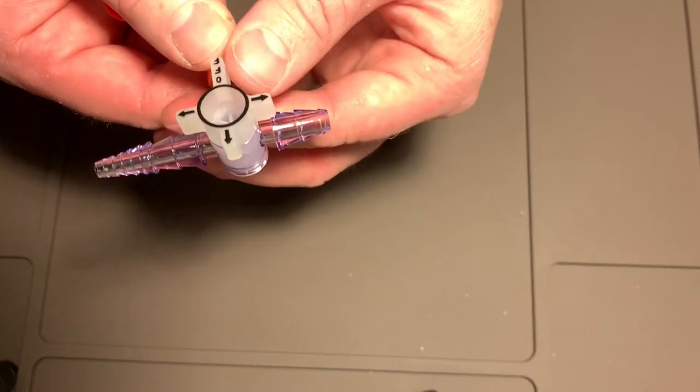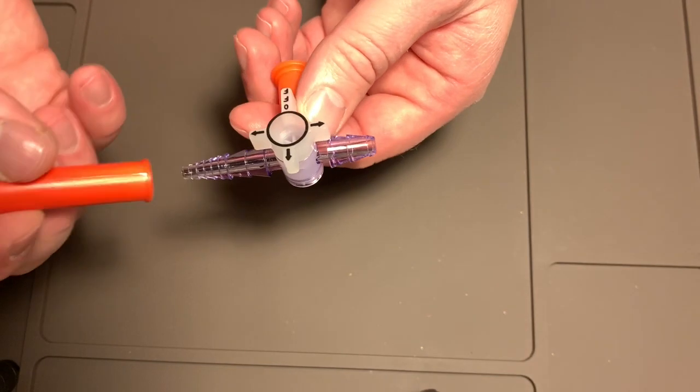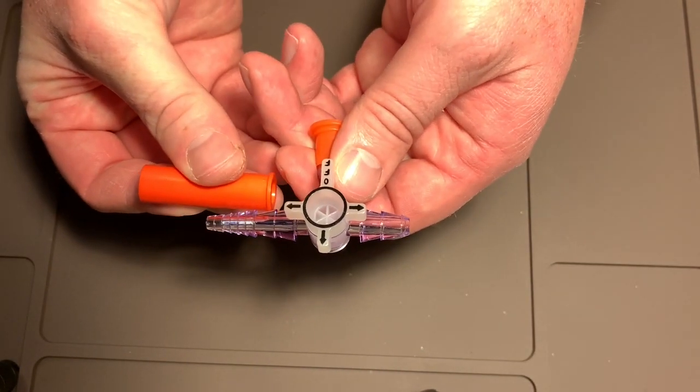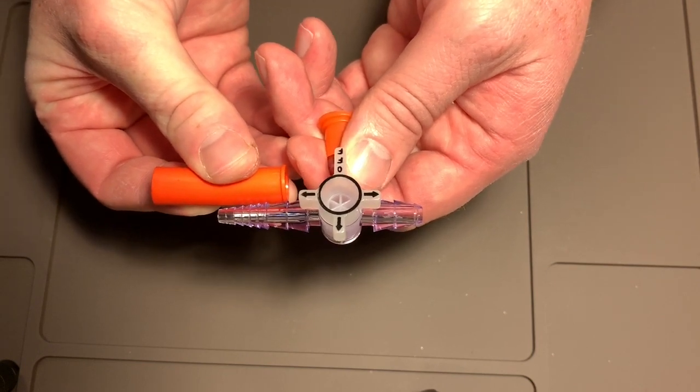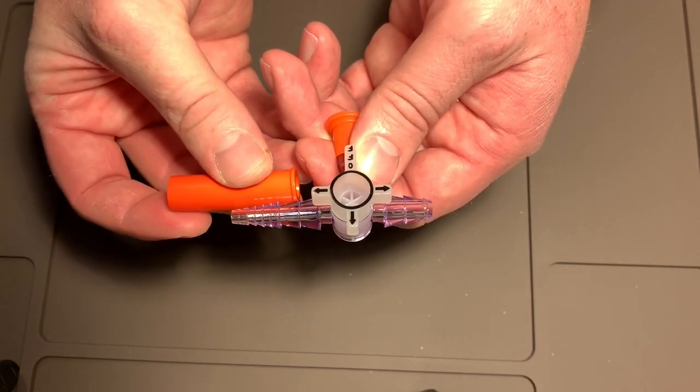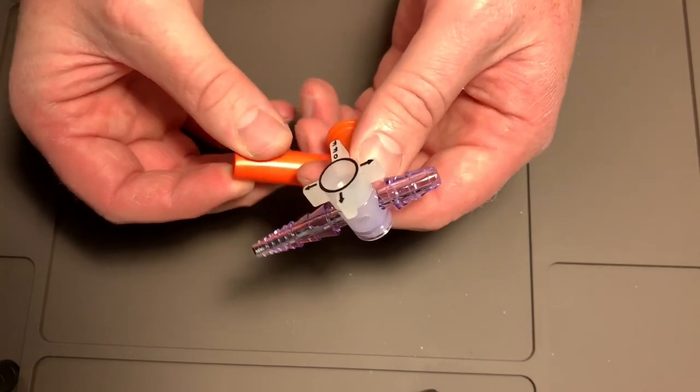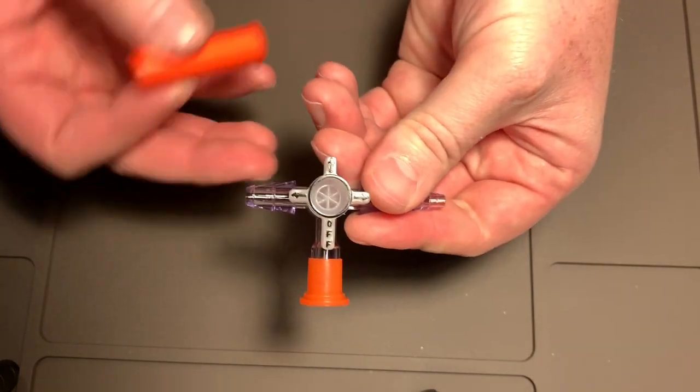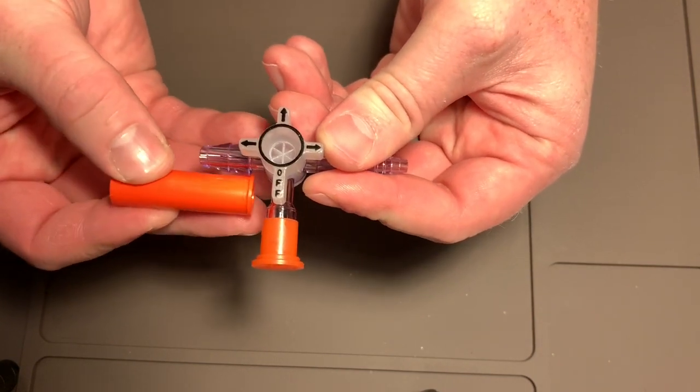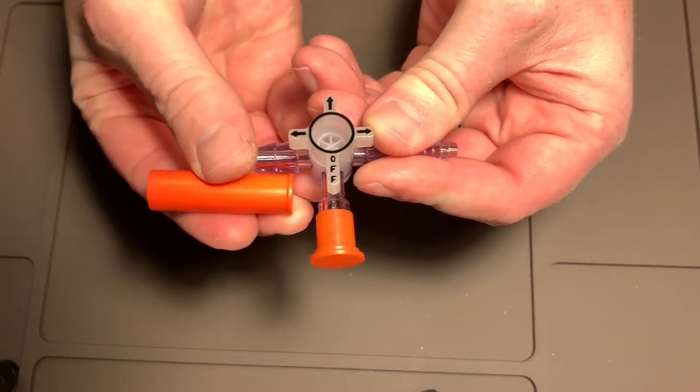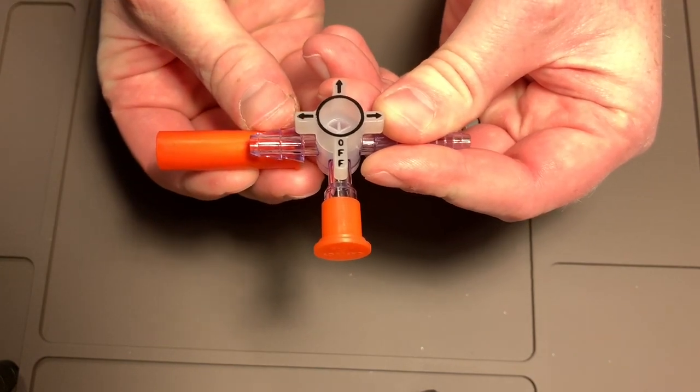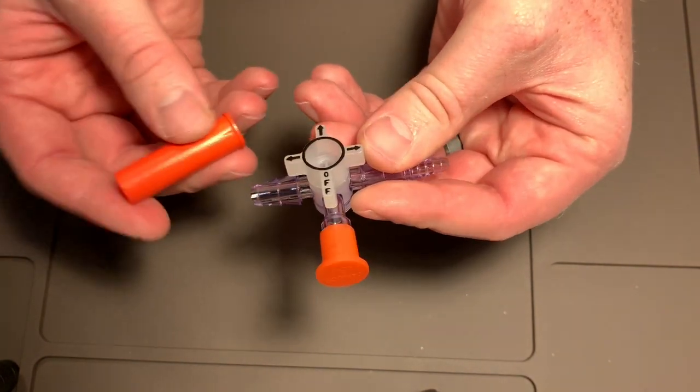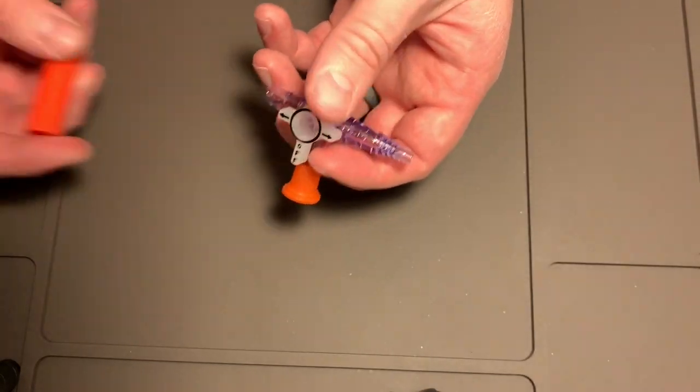But later on, if you end up having to give tube feeding, you can see this little connector piece here. If you were to have it on the long end, there's not a lot of room to put the nozzle in for your tube feed. Whereas if you put it on the short side here, you can see there's definitely enough room to put the nozzle for tube feeding. So that's tip number one.